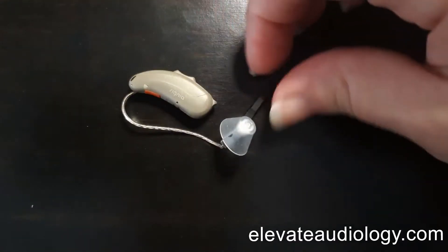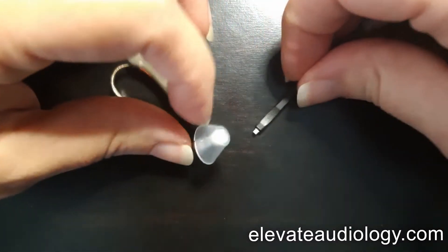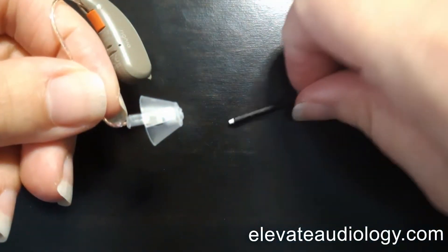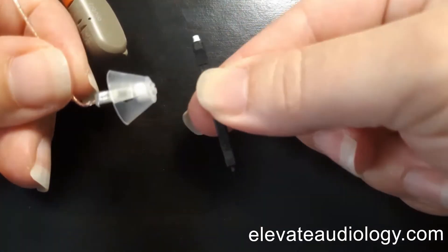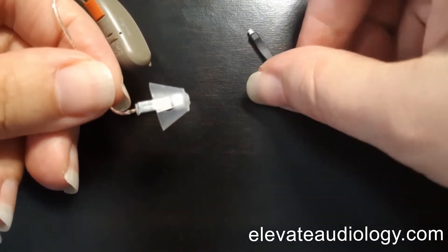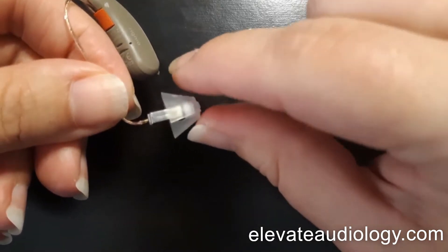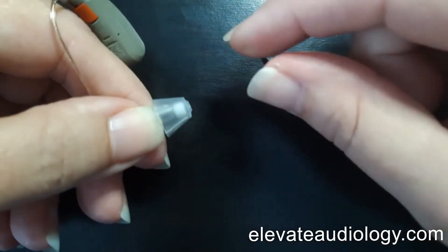To change the wax filter on a Signia Ricks style hearing aid, it's a little bit different. It still utilizes the stick style wax guard. However, the dome here is not just a friction fit — it's actually called a click dome.